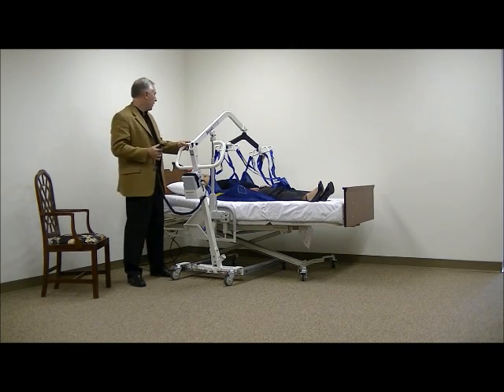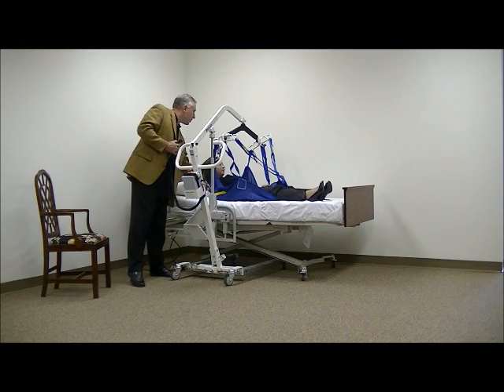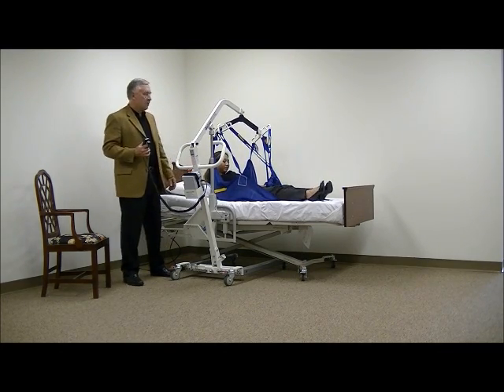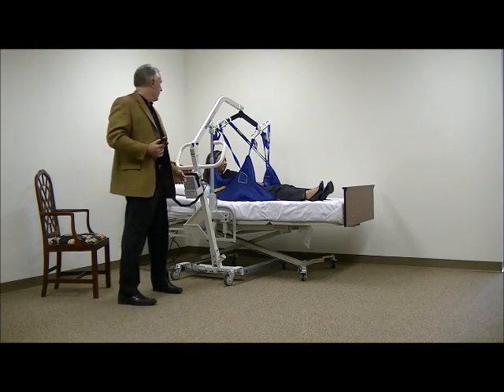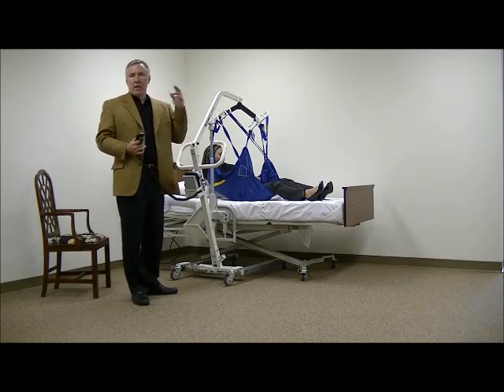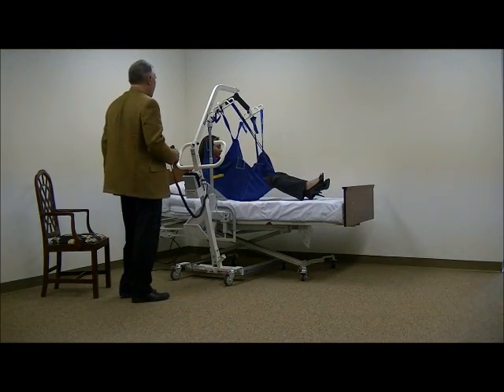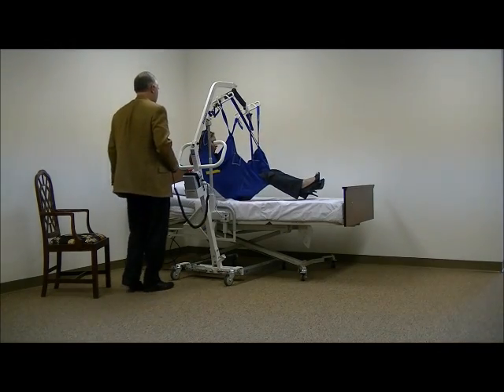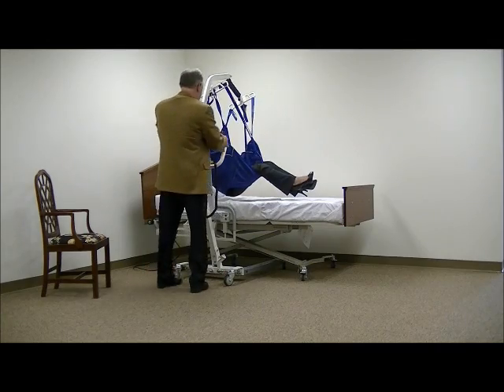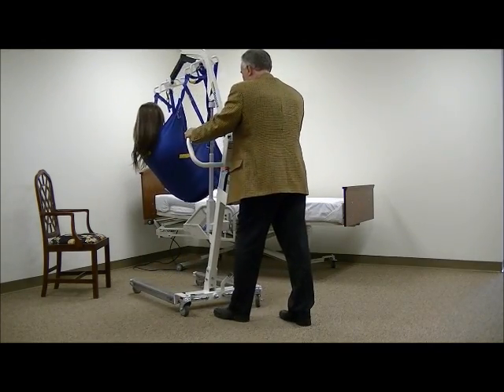So what we essentially were doing with the way we've attached the sling is that it's going to pull the head and shoulder area up first. And then you're going to see the legs getting tension last. So it pulls you into a somewhat seated position. So that way when I go from the bed to the chair, the patient's in a semi-sitting position. It makes it a little easier for me to position the person. Not the best job in the world of applying the sling, but it's going to have to do.